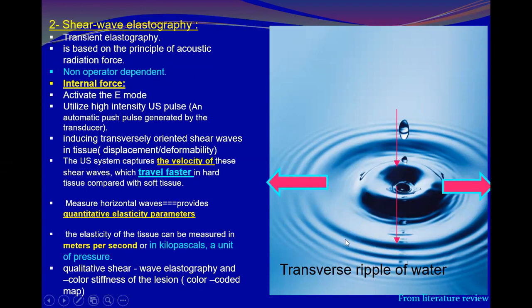If you look at this drop of water, don't look at the vertical effect down. Look how the ripples of water move transversely as an effect of this drop of water.